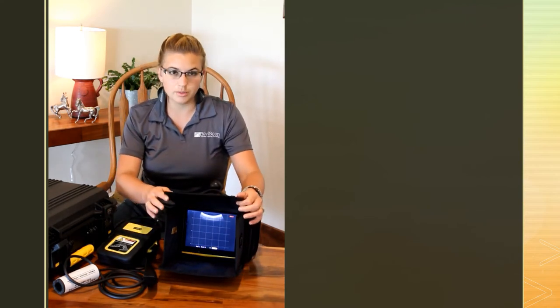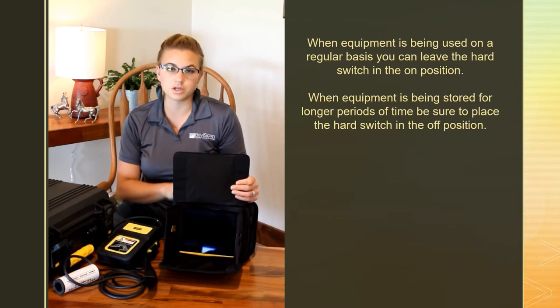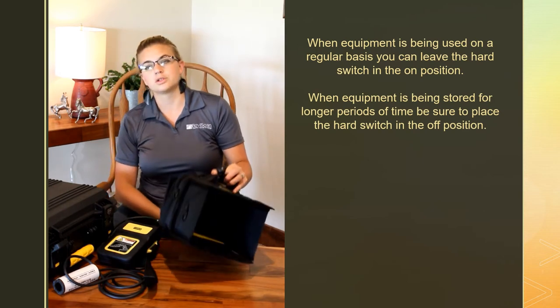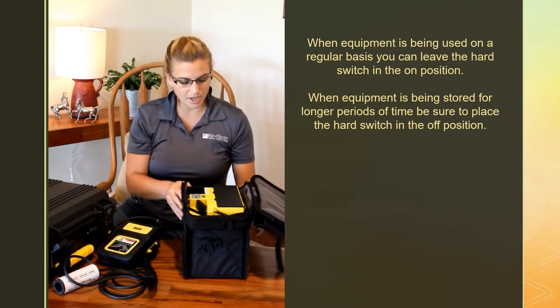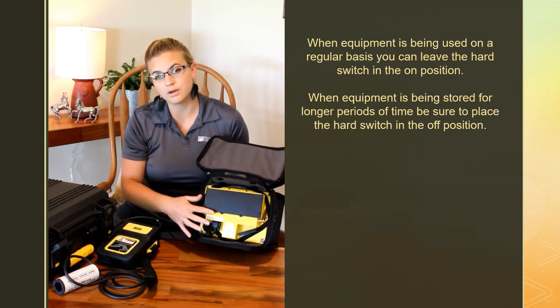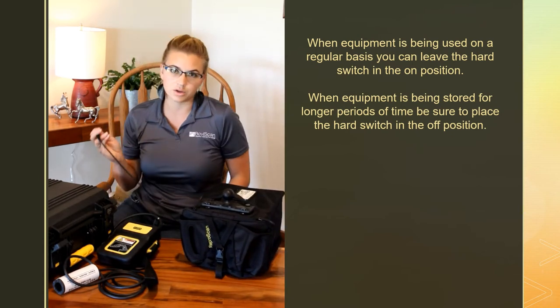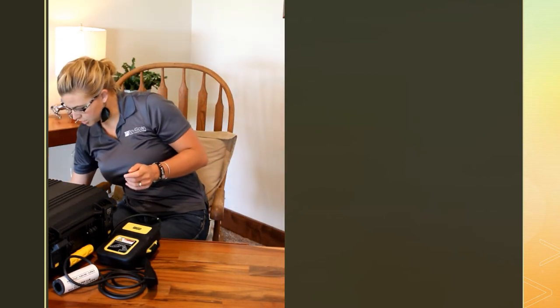When you are done, pressing the power button turns off the touch screen, but because this is a touchscreen it does have that small drain on the battery. When you're done, flip it over, open it up, and on the back there's a switch — turn that off for storage. When you charge it, make sure it is on so that if you charge it and then shut it off, it'll store with a full battery. That is your monitor setup.